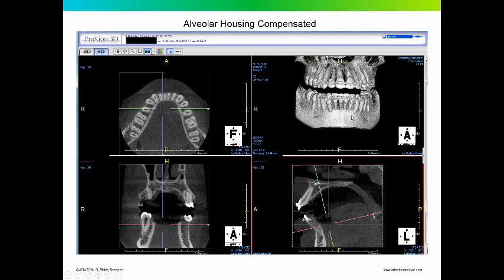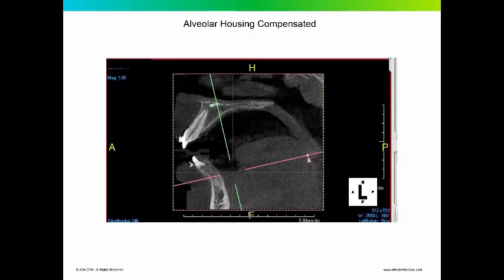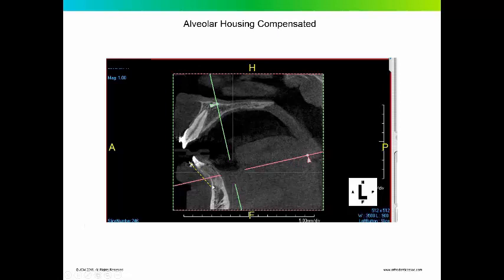By the way, this 3D reconstruction looks pretty bad, but it has not been adjusted to comport or represent the individual slices. These things are not really diagnostic. They give you a general idea. And here is that interceptal bone. You can see here is the interceptal cortical plate. The position of the root of tooth 24 is approximately where that yellow dotted line is. So that gives you an idea how much the tooth was pushed through the limitations of the alveolar housing.